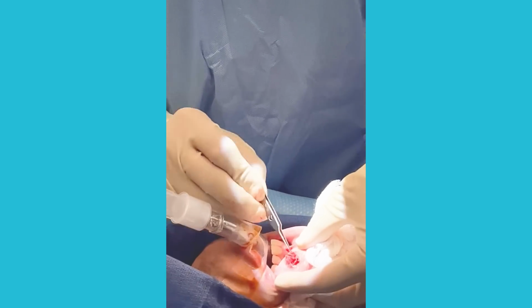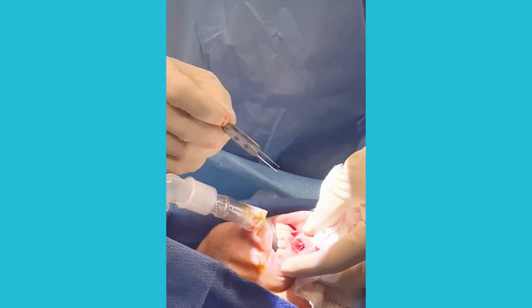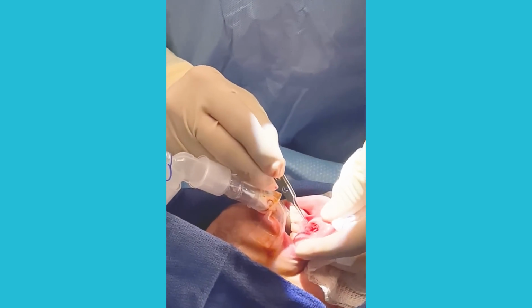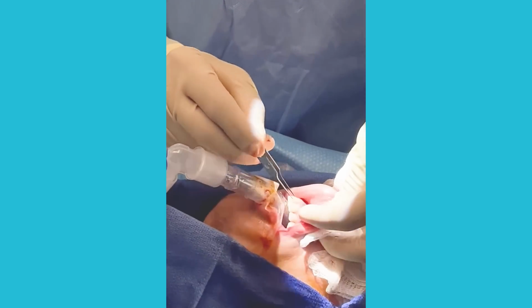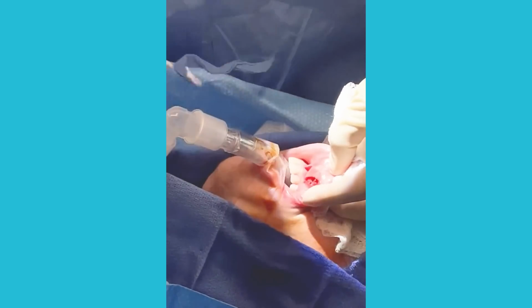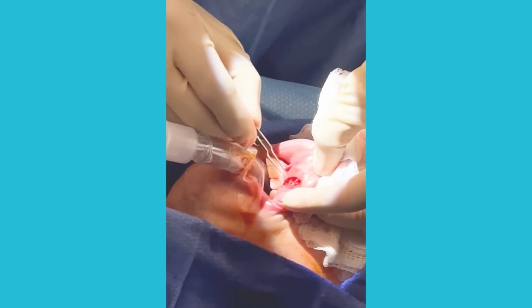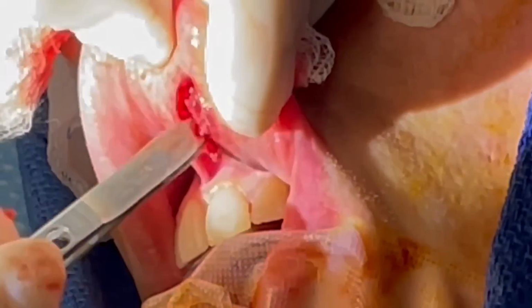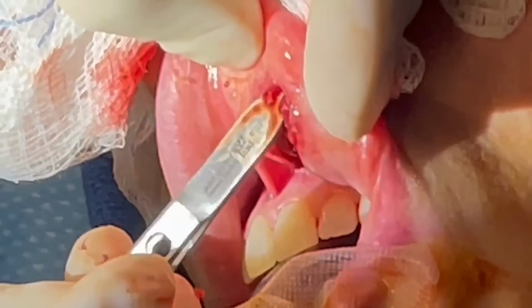That's very important. This is the artery that during filler injections you don't want to inject into. This is your orbicularis oris muscle right here, and also on the top right there as well. So we had to split the muscle to get to this structure right there. And we had to go digging deep in there to remove all the tissue. So this is a pretty big cavity. This whole thing is in there. So that's deep, so we have to dissect all around there, very carefully preserving the artery right there.